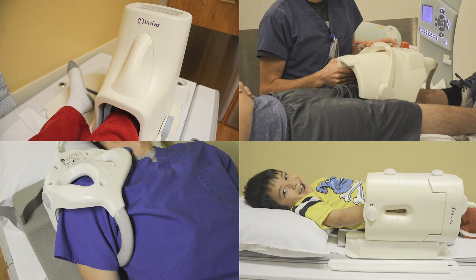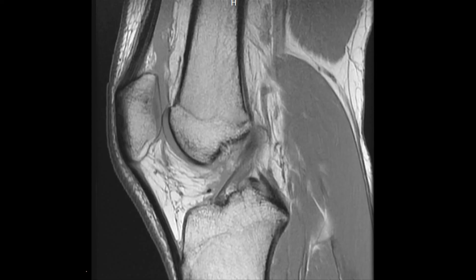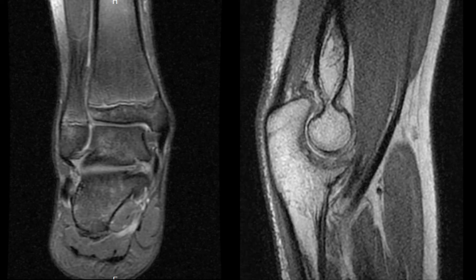Some coils can even be used to image more than one type of joint. The knee or extremity coil is used most frequently since the knee is the most common joint imaged by MRI. This coil can also be used to image other joints, such as an ankle or an elbow.